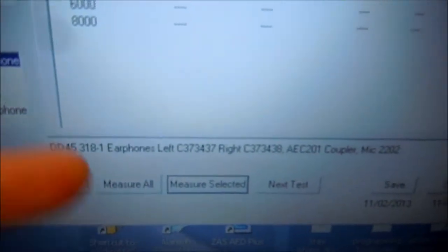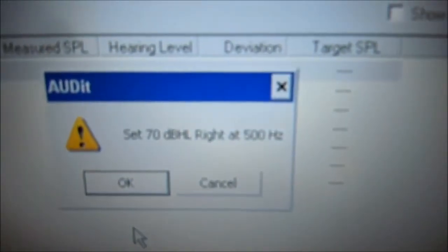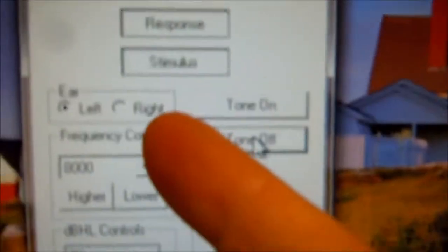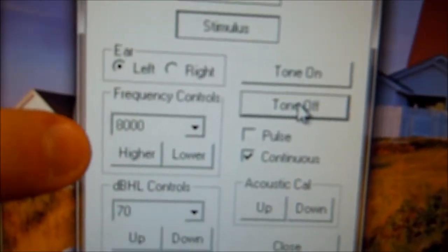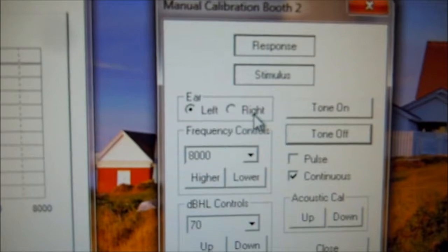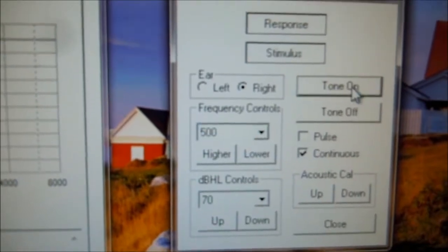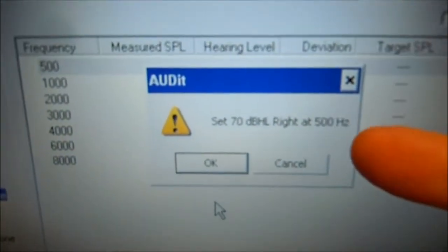So now we're just going to do the same thing as we did for the left side, now for the right. Again we're going to select measure all. It says set the audiometer to 70 dB at 500 Hz. Now we're going to select the right ear — 500 Hz, 70 dB — leave it at continuous tone and turn the tone on. We'll see the stimulus light. Select right ear, 500, 70 dB, continuous, tone on. Come back, 70 dB, 500, click OK.